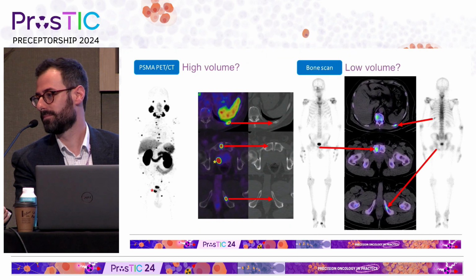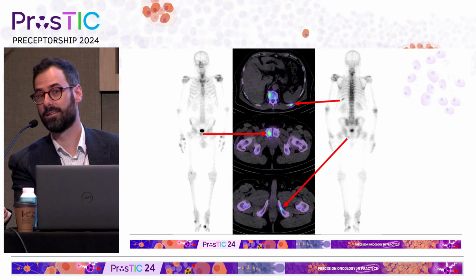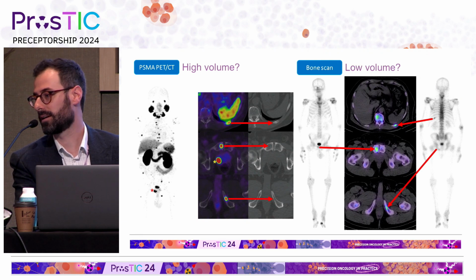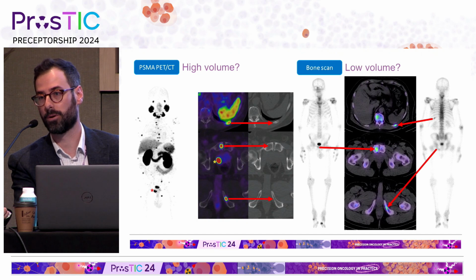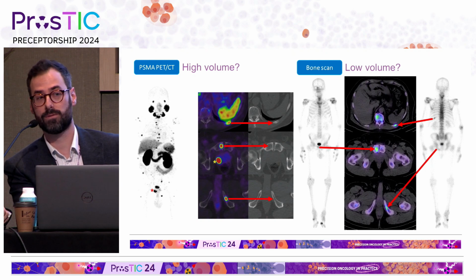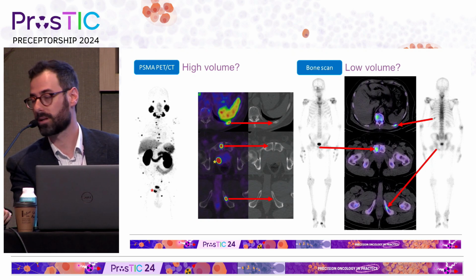And he did have a PET scan. So you can see the PET scan here, PSMA PET, extensive, highly avid, 20 to 30 bone metastases, very intense primary. See with little asterisks down there. So it's much clearer. I think we've seen a few interesting cases this morning like this.